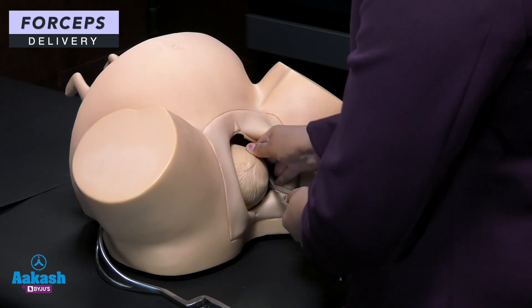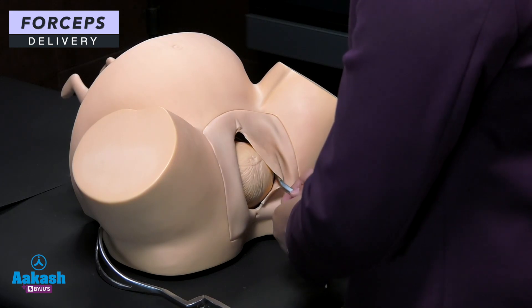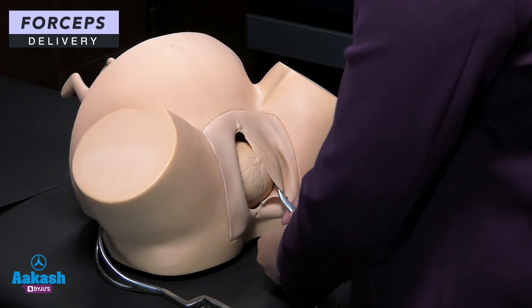Once one blade is inserted, you can leave it — it will not move. We don't need an assistant to hold this blade. It may move on the dummy, but in the mother you don't need to hold it.